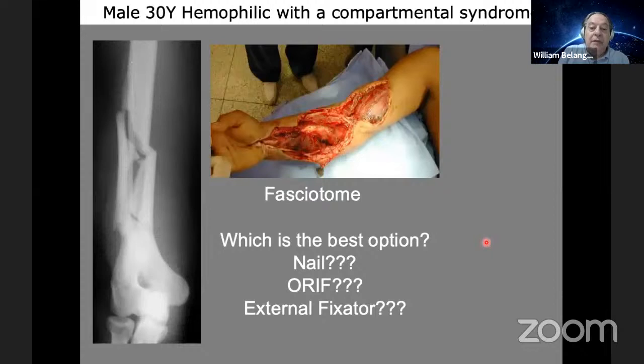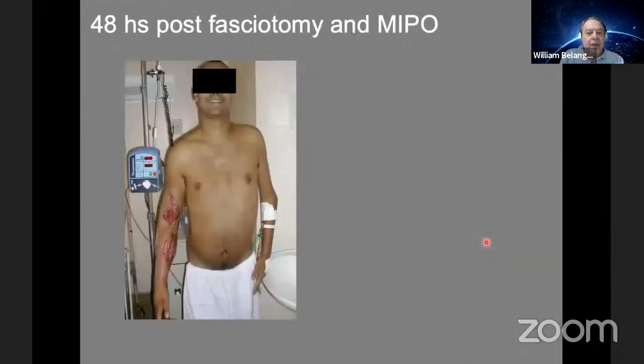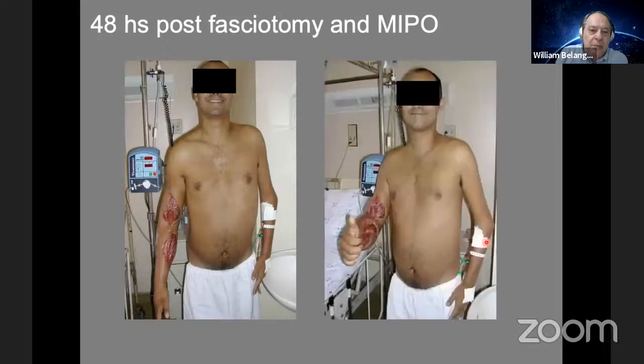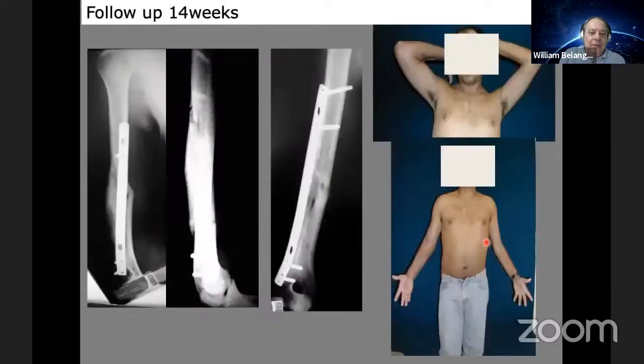Okay, we did a fasciotomy of the patient, and by using this fasciotomy, we slid the plate. This was the X-ray after the plate. This is the patient 48 hours post fasciotomy and MIPO. The radial nerve, it's okay. And there's the evolution of the patient with a very good bone healing and very good clinical result.